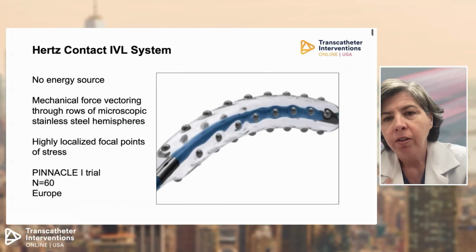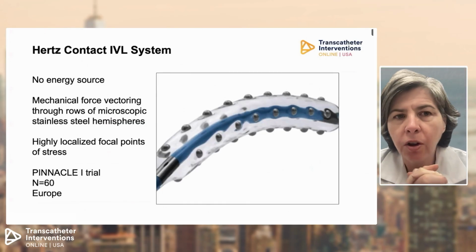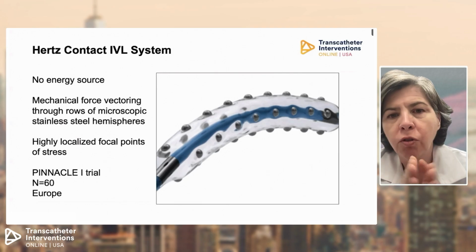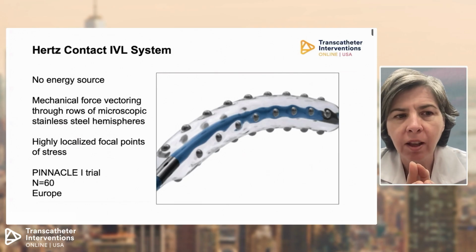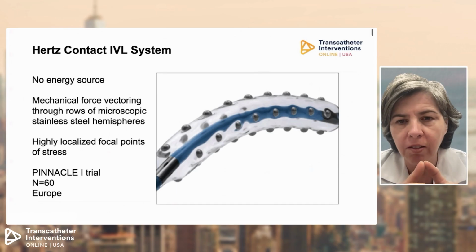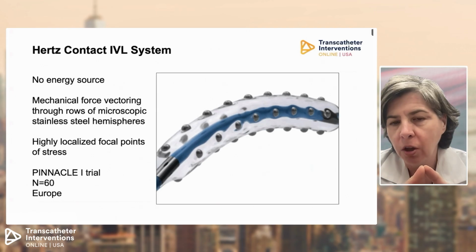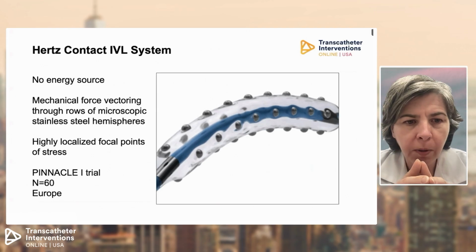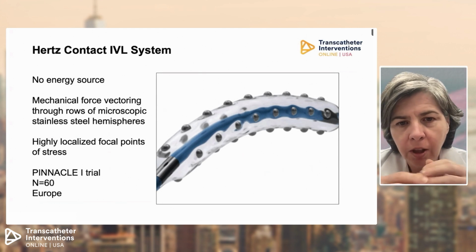Another technology that's of interest is the Hertz Contacts IVL system. Unlike the other lithotripsy systems, there's no energy source with this device. It uses mechanical force vectoring delivered through rows of microscopic stainless steel hemispheres, like you see in this illustration, creating highly localized focal points of stress.